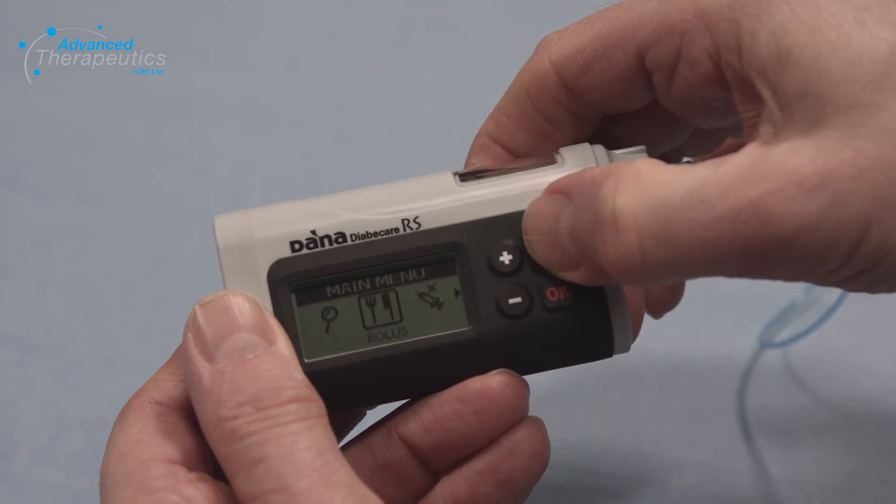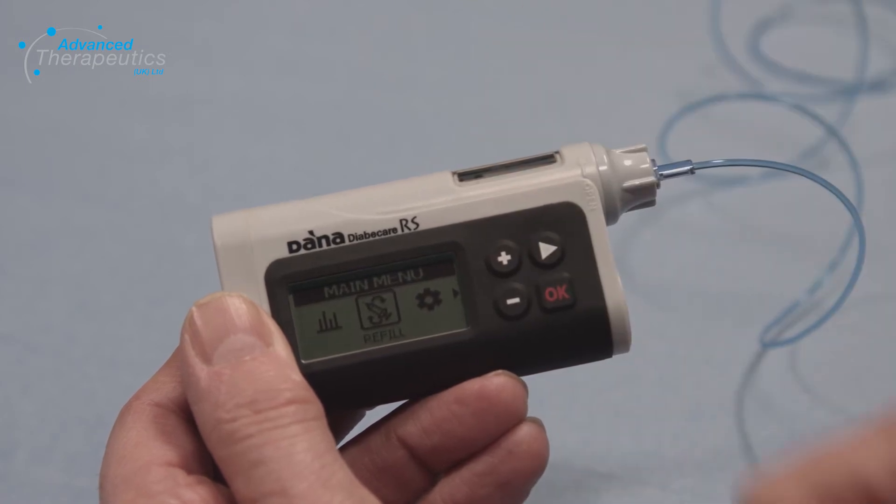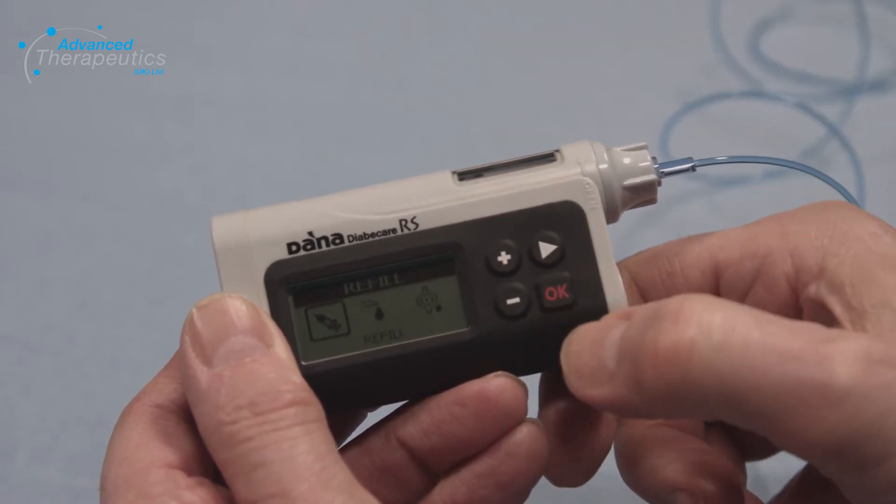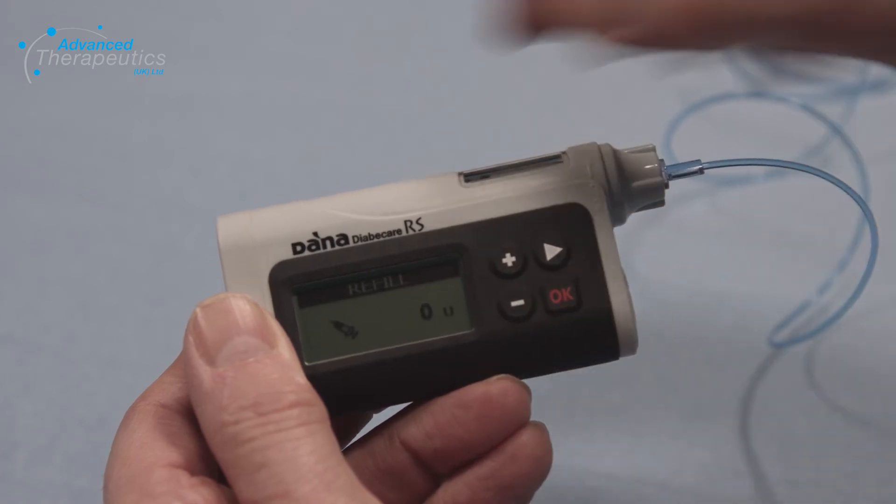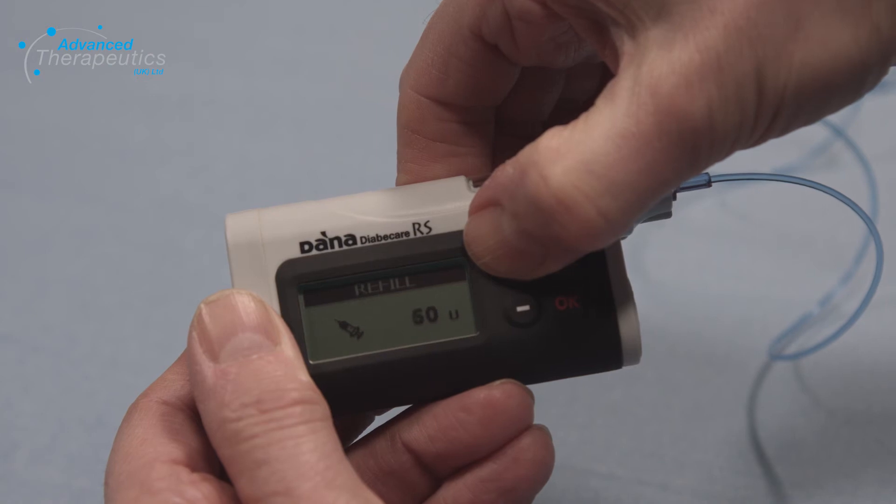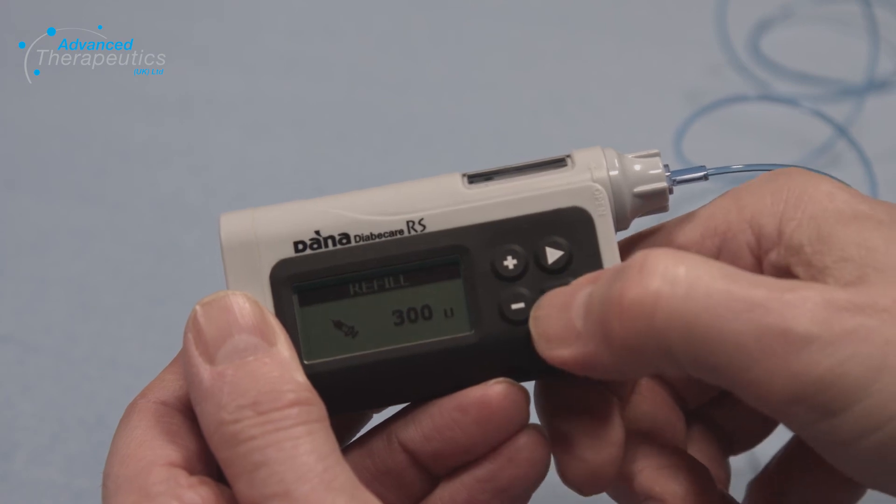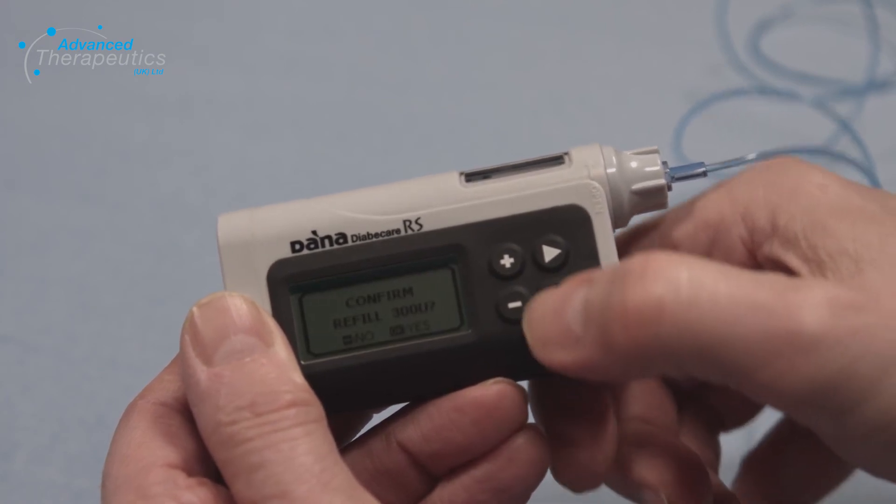Press the arrow key to move to the refill icon, then press OK. Press OK again and then press and hold the plus button. Wait until the correct amount of insulin is showing, up to 300 units. There needs to be at least 50 units in a reservoir for the pump to work. Press OK and then OK again to confirm the amount.